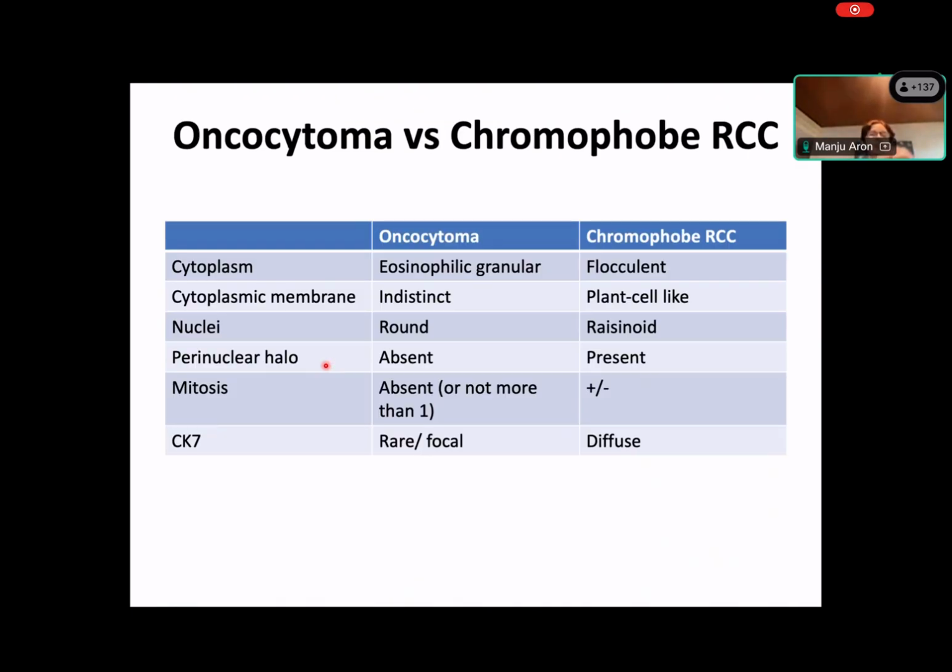So here's just a small table to show you the difference between these tumors. Both oncocytoma and chromophobe RCCs, especially the eosinophilic chromophobe RCCs, can have pink cytoplasm, but there's a difference in the characteristic features of the cytoplasm as is listed here. Cytoplasmic membranes, again, indistinct in oncocytoma, very prominent in chromophobe RCCs, and the nuclei. That is really, really important to distinguish oncocytoma from chromophobe. Now, the stains, they're positive both for CD117. They are usually negative for CK7 in oncocytoma, or you may see rare scattered CK7 positive cells. Chromophobe RCCs are diffusely positive for CK7. So CK7 is a good stain to distinguish the two of them.